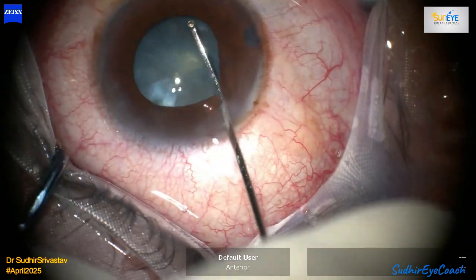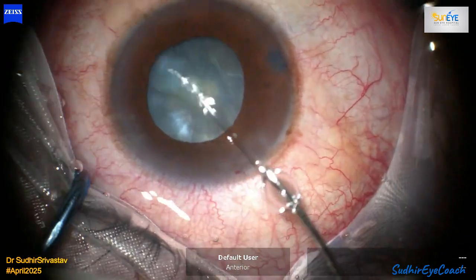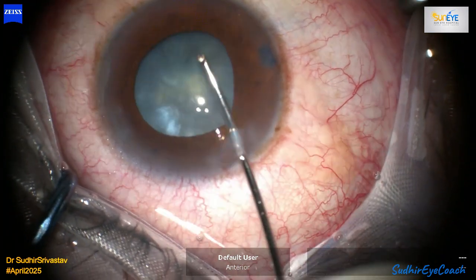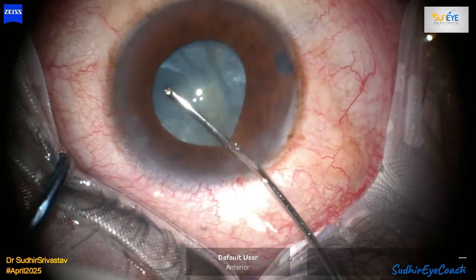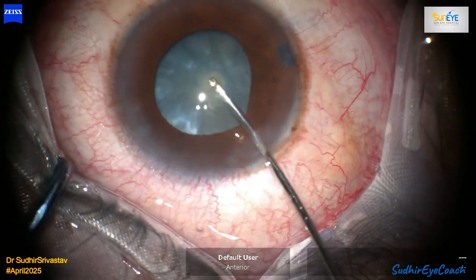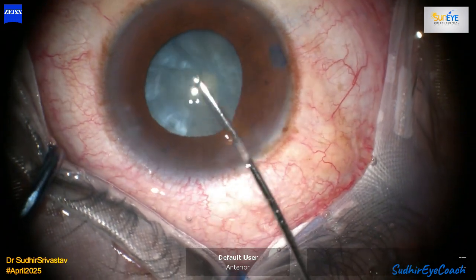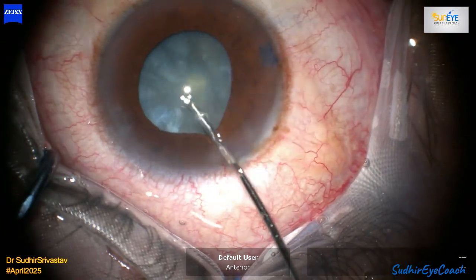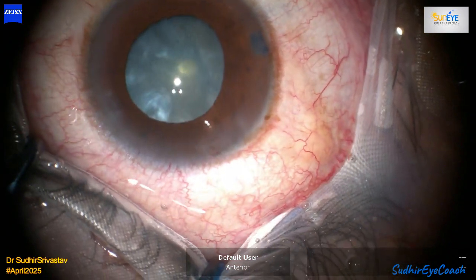Fortunately, the capsular rhexis was slightly small and ideal for optic capture. With multiple attempts and gentle manipulation, I was able to successfully achieve optic capture of the IOL optic within the anterior capsule rhexis. I thoroughly checked its stability by gently tapping the IOL, flushing the anterior chamber with BSS, and ensuring centration even with the IA cannula.